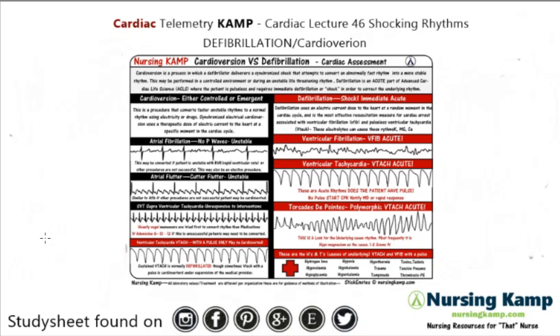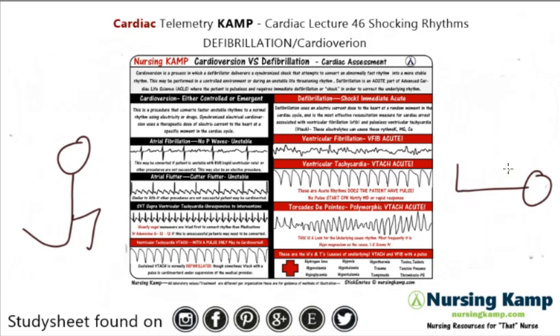So as an overview, you cardiovert elective, alert people, and you defibrillate or shock dead people, people without a pulse, and you try to convert their rhythm. A person who's being cardioverted will walk into the office to have that rhythm changed, whereas the person who is having a code doesn't know you walked into their office and you shocked them.